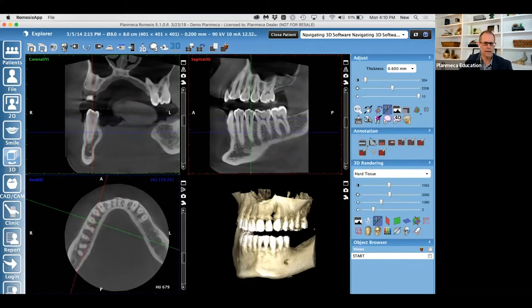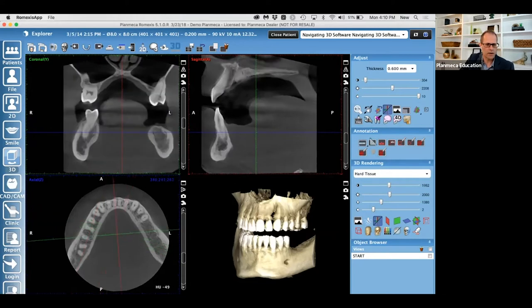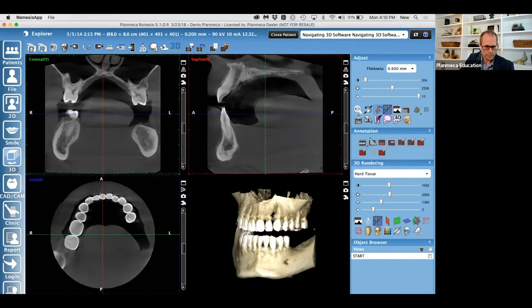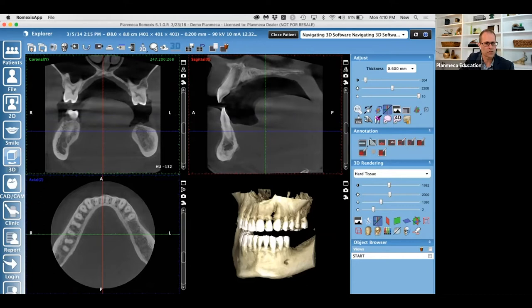So hopefully that was clear and kind of gives you a good starting point of how you look at an image. If you ever take courses from a board certified radiologist, one of the things they will share with you is you basically want to look at symmetry. So you can go through your scans and get everything lined up so everything is symmetrical, so that you can compare left sides from right sides and you can understand what they would call normal versus abnormal. So basically having your image set up in a balanced sort of format is the best thing that you can do.